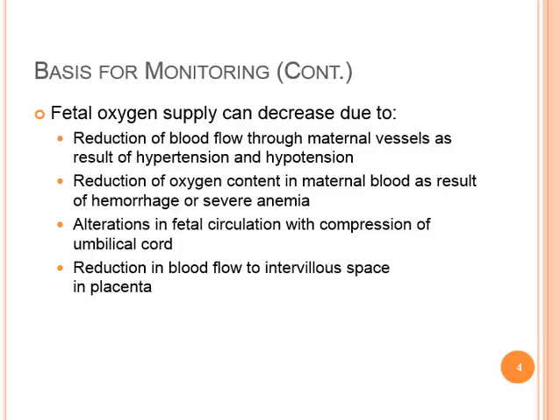And like we talked about in class, when we're looking at the fetal tracing, we're looking at how the heart rate reacts to the contraction, specifically the peak of the contraction. So if the heart rate goes down before the peak of the contraction and is back up by the end of the contraction, we call that an early deceleration.